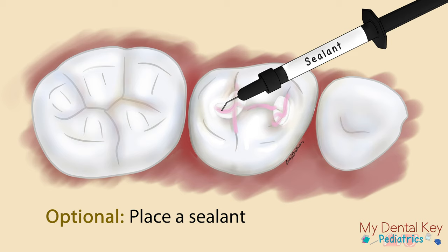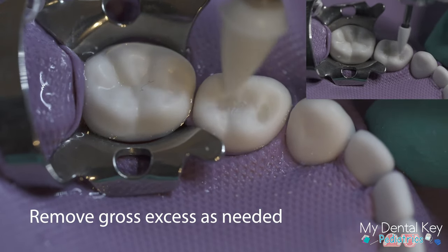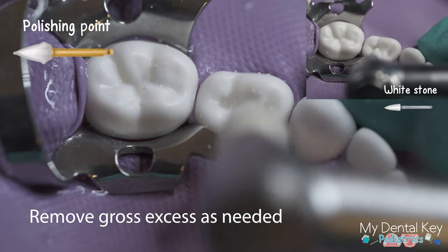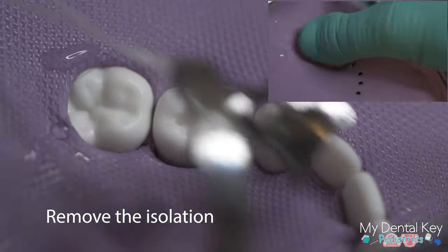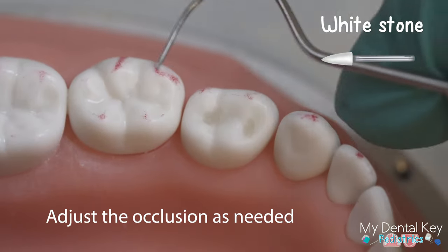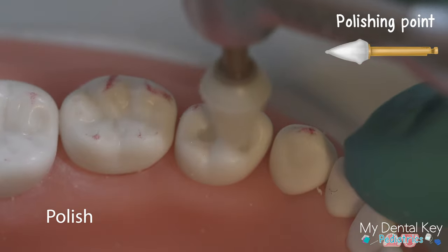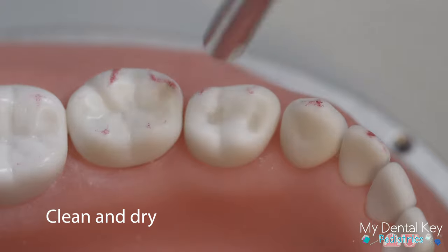Check out the My Dental Key sealant page for full details on the sealant procedure. Remove any excess composite using rotary instruments; options include the white stone on high speed or the rubber tip on slow speed. Clean and remove debris from the rubber dam before removing the isolation. Use articulating paper to check the occlusion, making any adjustments as needed using the white stone or polishing point. Finish by polishing the restoration with rotary instruments, then clean and dry the restoration using the air water syringe.